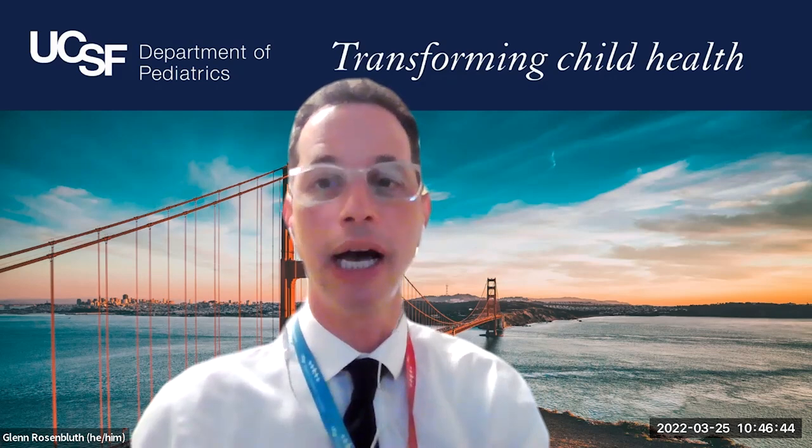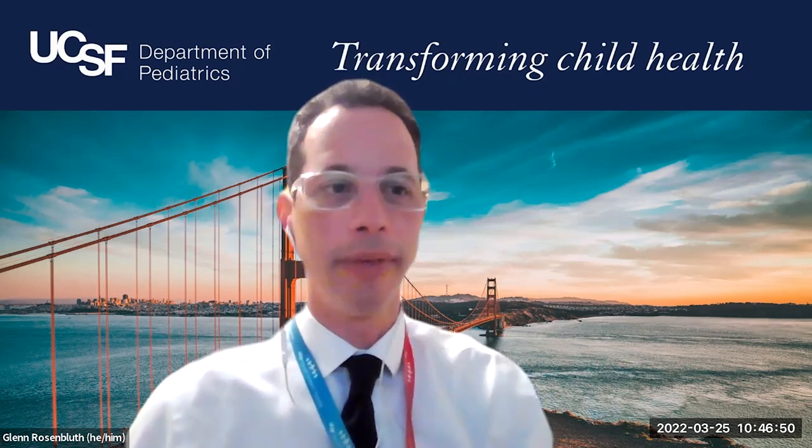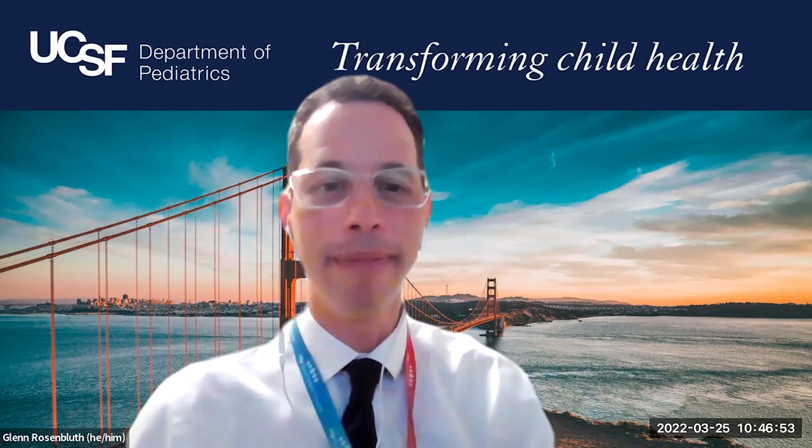Yeah, it's a great question. Before families can leave the hospital with a child or dependent who has a tracheostomy, they have to be taught how to change the tracheostomy and they have to demonstrate their ability to do so. So we do expect that as a skill if the tracheostomy should come out or become clogged for some reason. We would advise people, if they're ever concerned about the tracheostomy tube and can't get a new one in immediately, to call 911 immediately. Don't hesitate. Don't wait to see if you can find that backup tracheostomy. Just call 911 and get emergency care there immediately.